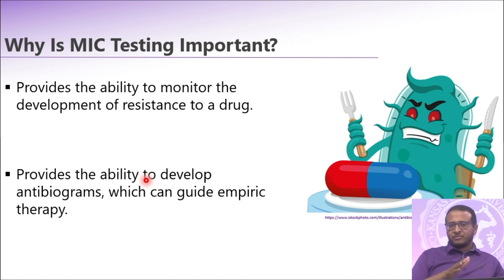And then after a while, the dog came back again with the same complaint. We collect another ear swab and send it to the bacteriology section. We grow the same Pseudomonas aeruginosa, but at this point, the MIC for drug X becomes 8 micrograms per mL. Now there is some level of resistance that this bug is building, and the MIC or the broth microdilution allows us to monitor that.